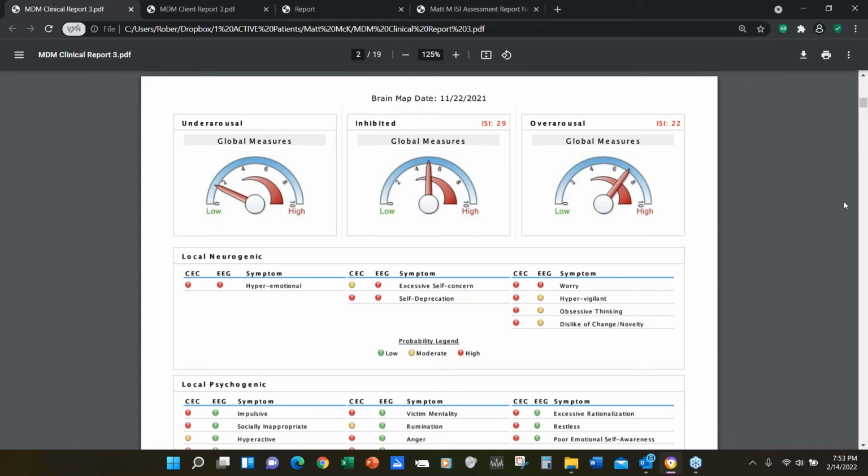I'm very similar to you. I pick and choose the concepts I want them to understand. I try for concepts versus particulars, so that I think I can help them. You know, there's the old saying: if you give a man a fish, he has a meal. If you teach him to fish, he has food for a lifetime. That's what I see myself as doing here. Let's talk about the concept. I do that a lot, so I really appreciate what you said.